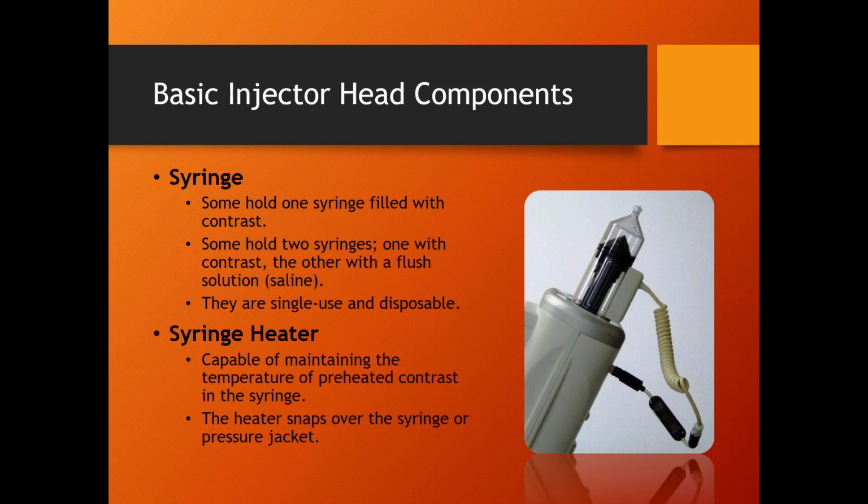Enter. Then down here, I can select a second phase. This would make it a 2-phase injection. I can select contrast A, contrast B, or a mixture of the two. I can also select pause and hold. We'll talk about that in a minute. So let's select a different fluid, 5, 20, enter. So there, we have a 2-phase injection.